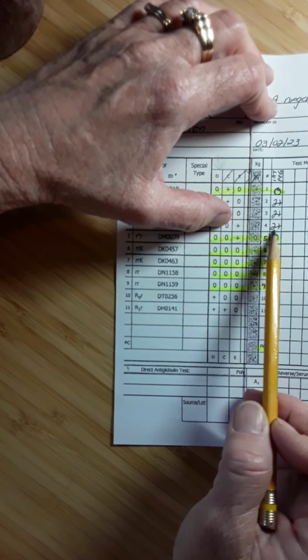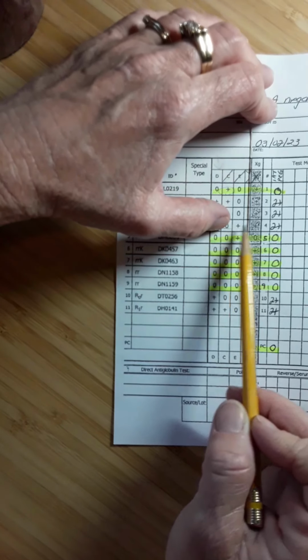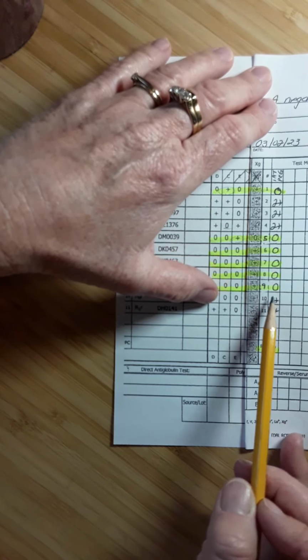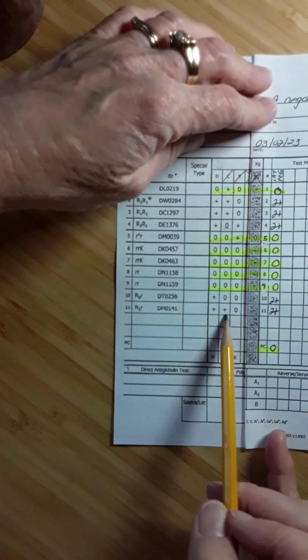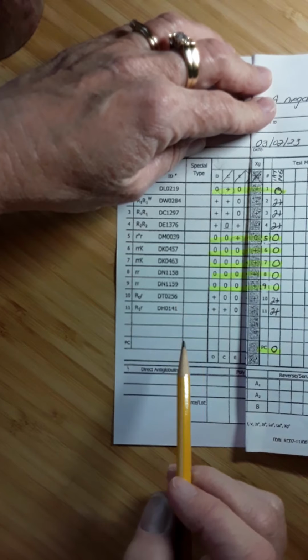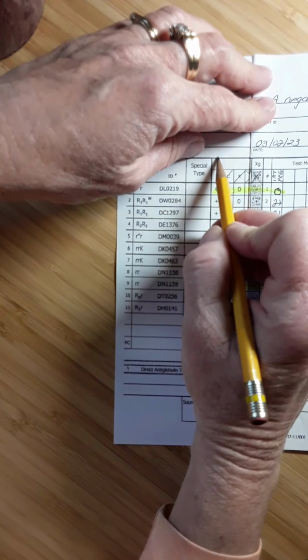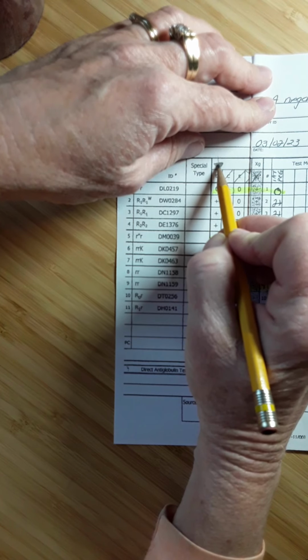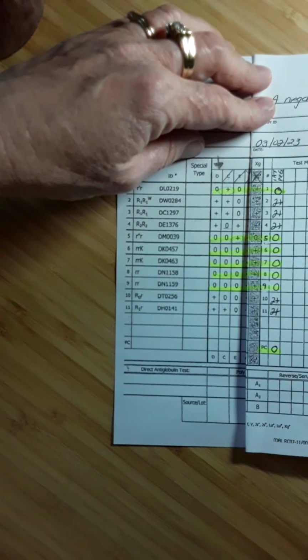We would expect negative with cell 4, and then negative for cells 5 through 9, negative for cell 10, and we would expect positive. So no, the pattern for C and E don't quite match. So I really feel that I have an anti-D present. So I'm going to stick an arrow up on top of anti-D because that's the antibody that I think I have.